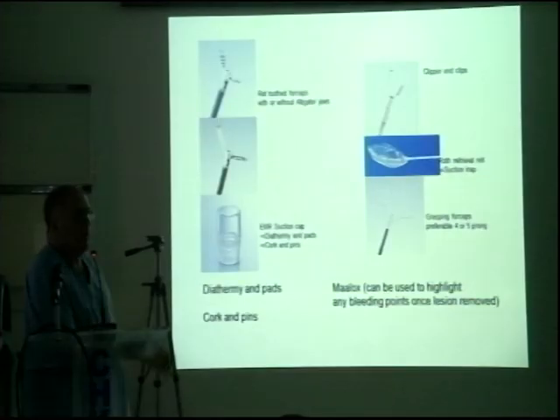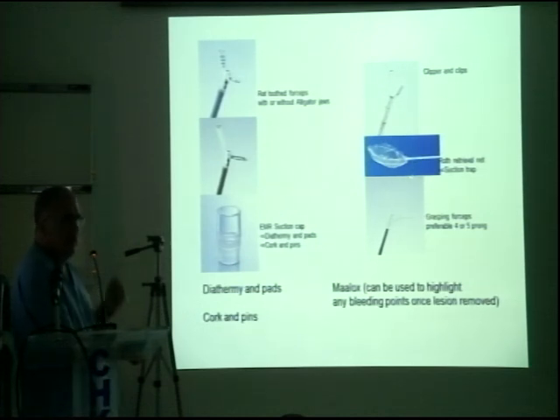A lot of these nets come along. Can you see this has got a nice little cup? But there are some that look like tennis rackets and they're very stiff, and you're forever trying to do things. The Roth net has a very stiff plastic sheath. This stiff plastic sheath can actually go through a bowel wall very easily. So I get the staff to open the Roth net in the scope, and I then deliver it over the polyp. If I'm working with a new member of staff, I'll pass the plastic of the snare out, draw it back into the scope, and ask the brand new member of staff to open the snare in the scope.